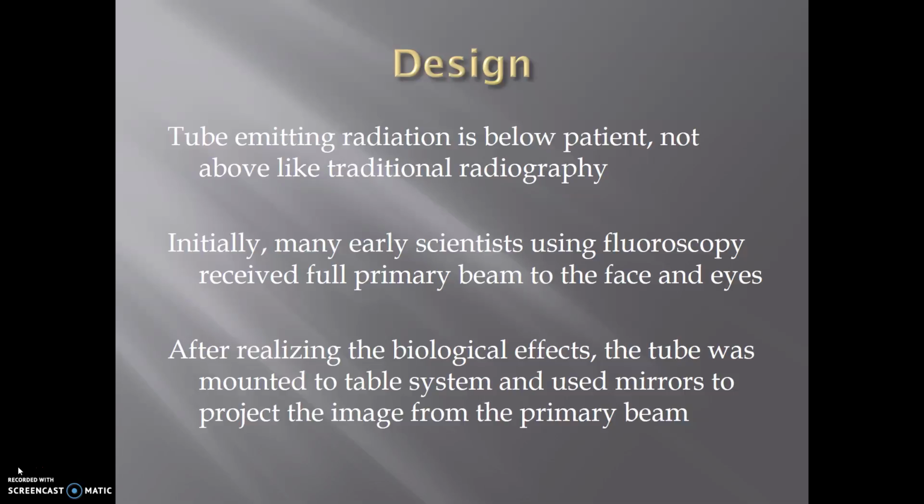Initially, many early scientists using fluoroscopy received full primary beam to the face and eyes. After realizing the biological effects, the tube was mounted to the table system and used mirrors to project the image from the primary beam.